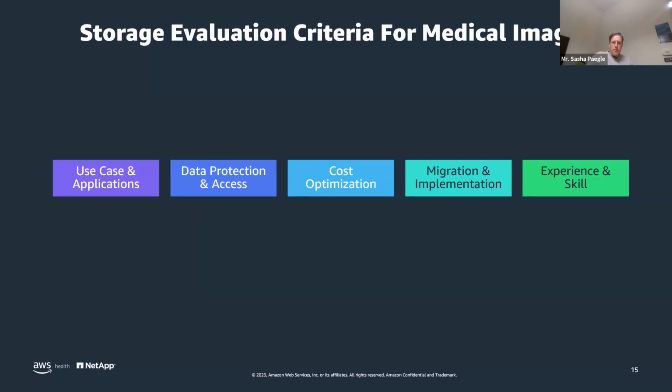All right, lots of choices. And when I first started at AWS, usually the first question I hear is, how much does it cost? How do we price out the storage? I want to acknowledge, yes, understanding the cost to store is important, but I would like for all of you to consider how to evaluate the cost through the lens, first, of your actual use case and the requirements driven from that use case, versus jumping directly to the dollar per gigabyte per month storage cost.